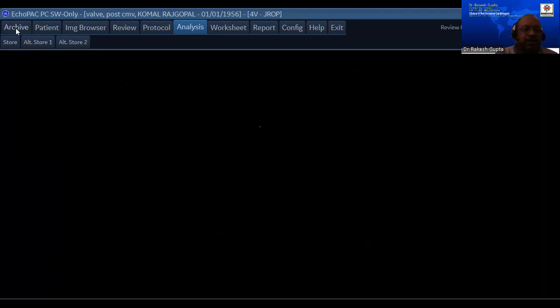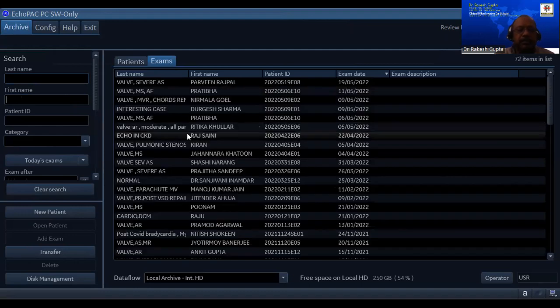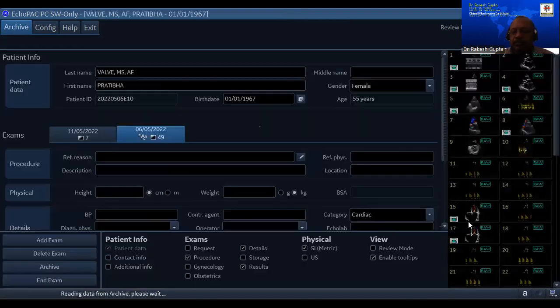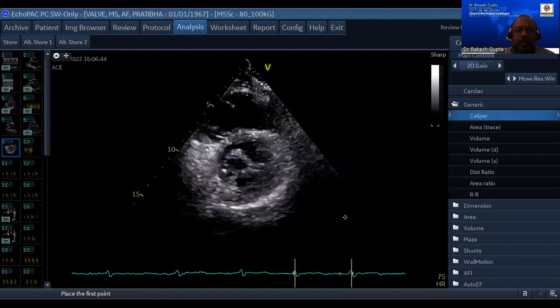Let me now go to severe mitral stenosis and atrial fibrillation. All right.